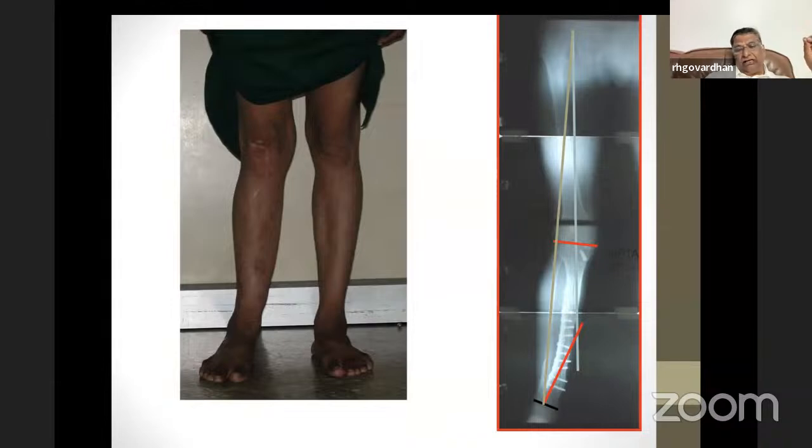So we drew a line from the distal tibia for the lateral distal tibial angle, and these two lines met away from the tibial line. So the apex of the deformity is not within the bone, but away from the bone, which means that there are two apices of deformity, which can be very easily delineated by a central line like this, which is an axial line.